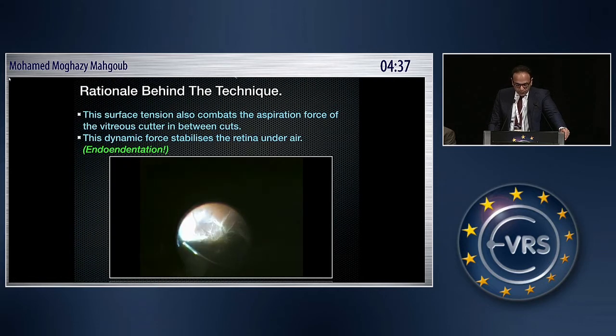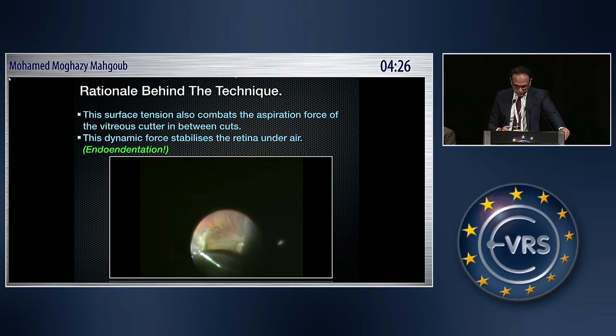This surface tension also combats the aspiration force of the vitreous cutter in between cuts, and this dynamic force stabilizes the retina under air — what I like to call endo-indentation. As you can see here, you can shave even very close to the retina over areas of lattice degeneration with very sticky vitreous, safely, without creating breaks.